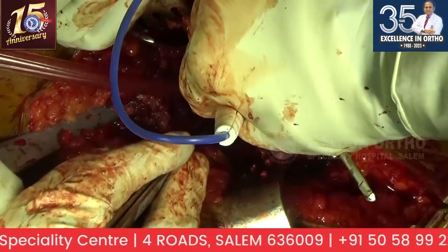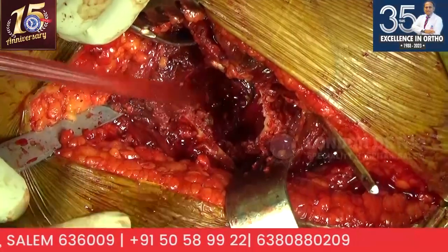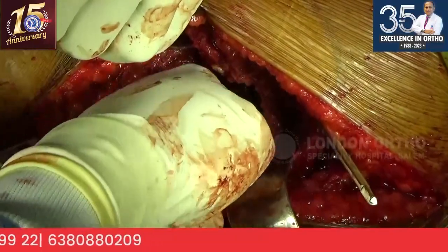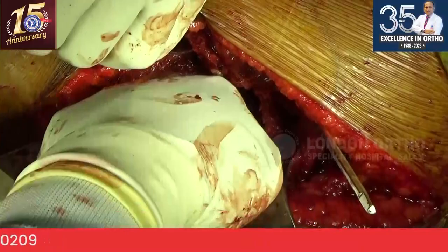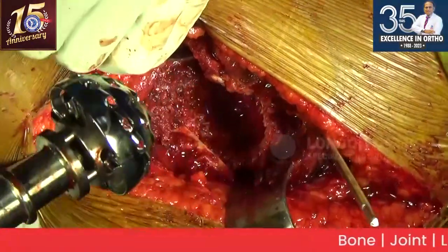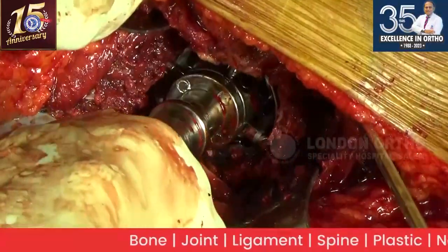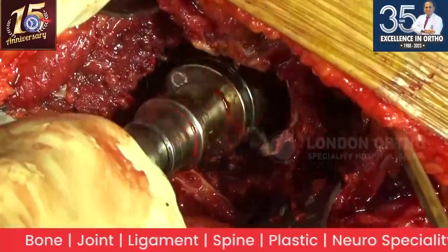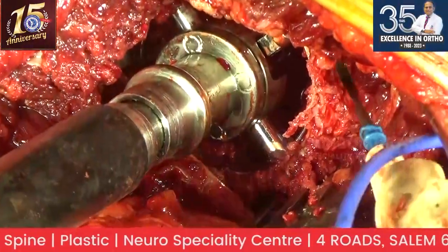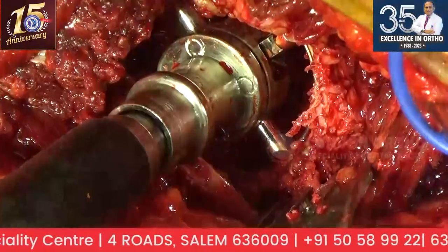This sclerotic bone was not as bad as I thought, or the reamer is good. So I'm again touching and feeling. I'm almost at the medial wall. Good, okay. This is the 46 reamer. Yeah, now I am on the medial floor. You can see from the lateral wall it dipped in and it is curetting it. I don't want to push it anymore.